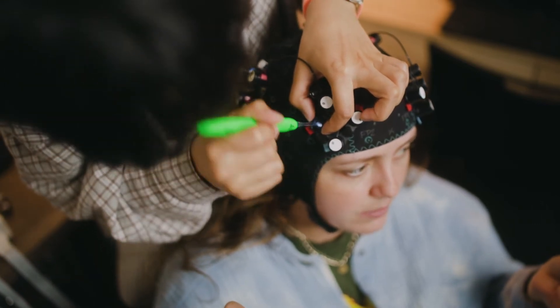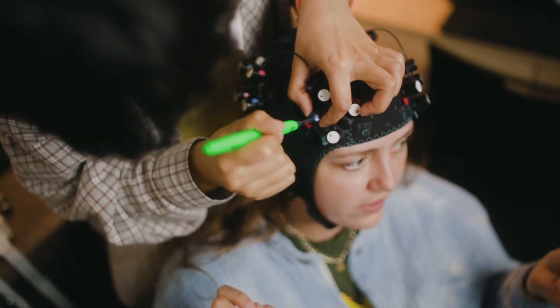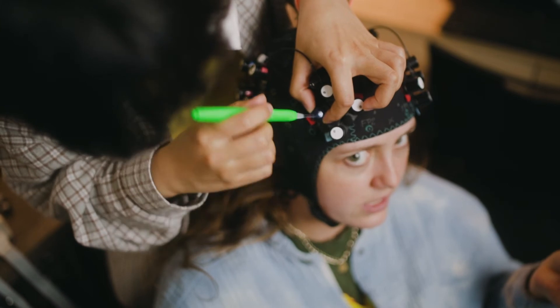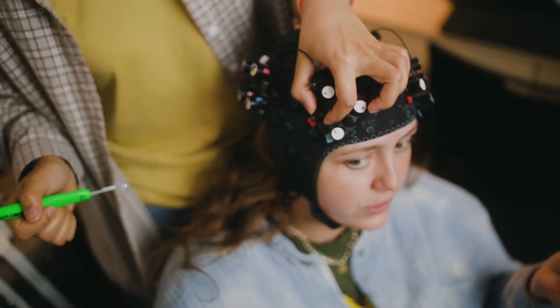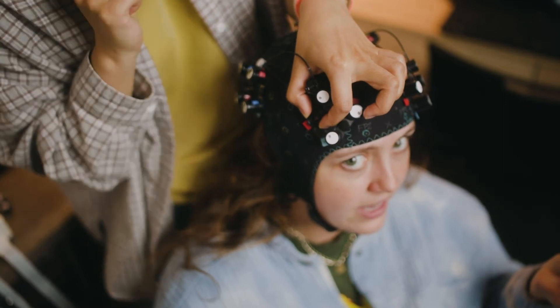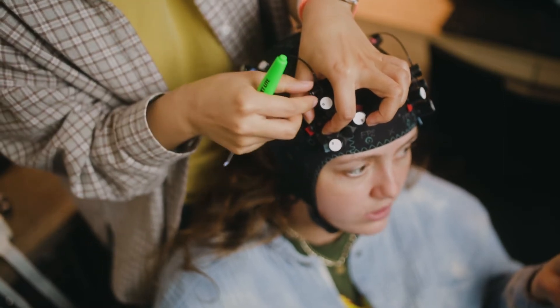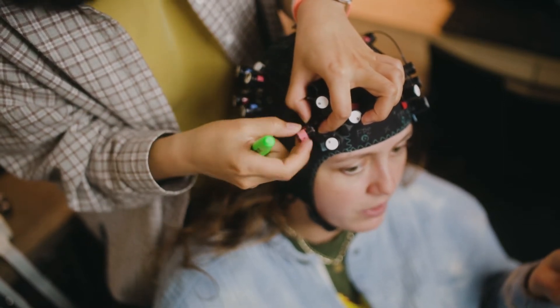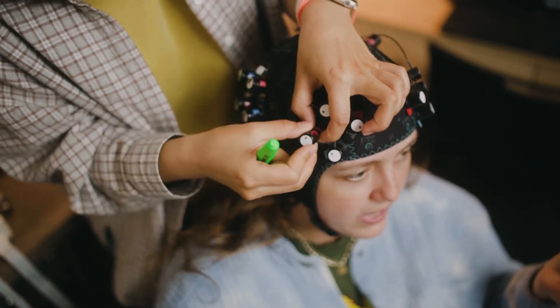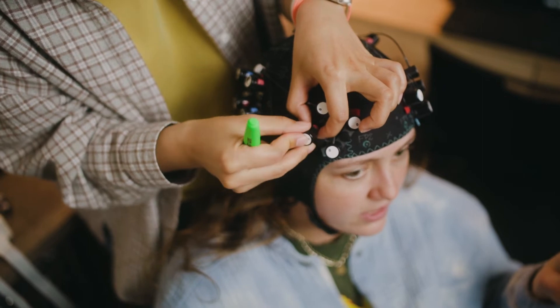A lot of times in the parietal areas, people have thicker hair, that's why there's no signal. Something she is careful not to do is use the hook side of the crochet hook, so she's not hooking hair and pulling it out of the hole — because then it gets tangled and it hurts the participant when you take the cap off. It's important that you use the smooth back side of that hook to part the hair.